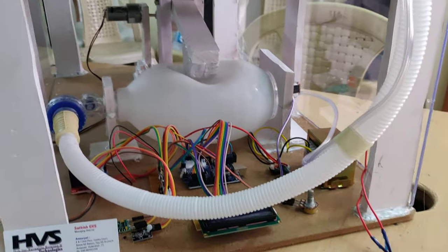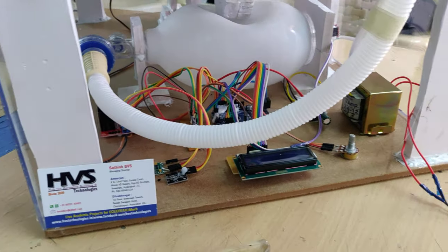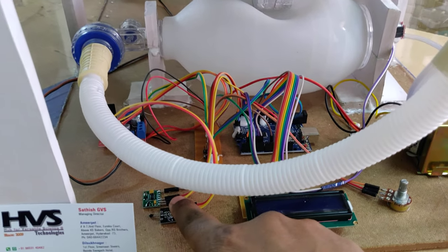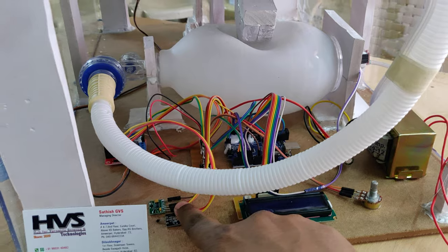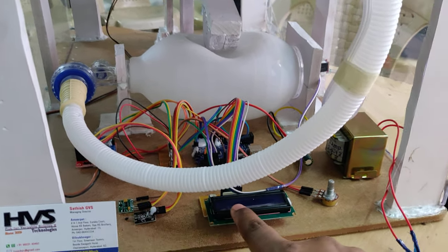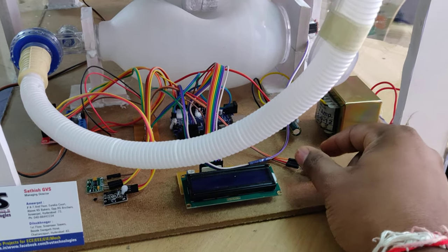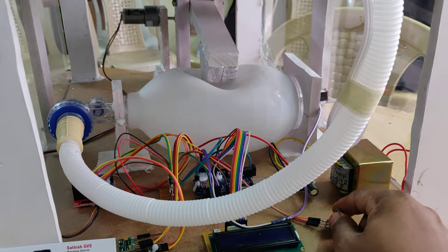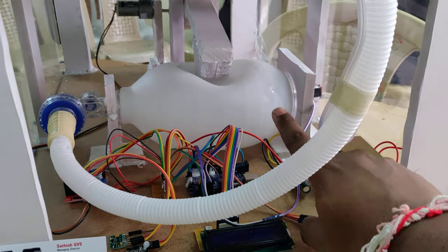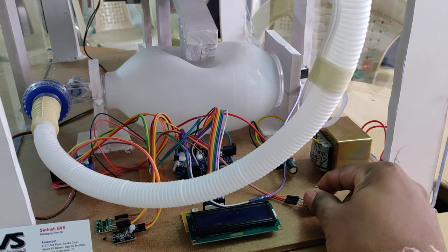Arduino board. And here we are using another two sensors to monitor three health related parameters. One is a MAX30100 sensor which gets the heart rate and SpO2, and next is the temperature sensor, a thermistor. These three parameters are continuously monitored on the 16x2 LCD screen, and we also set the pressure, meaning the speed of this DC motor, to control the pressure on this ventilator balloon. That is done with the help of this potentiometer, increasing and decreasing.